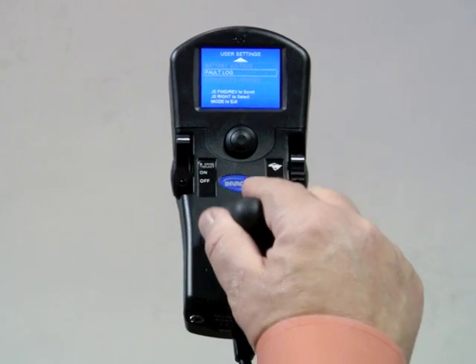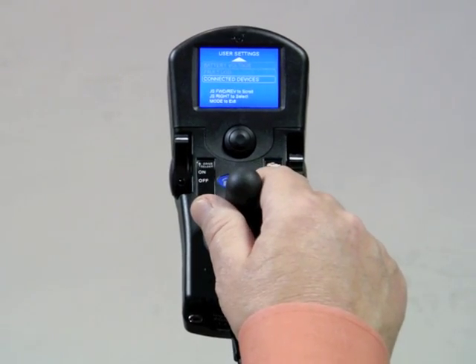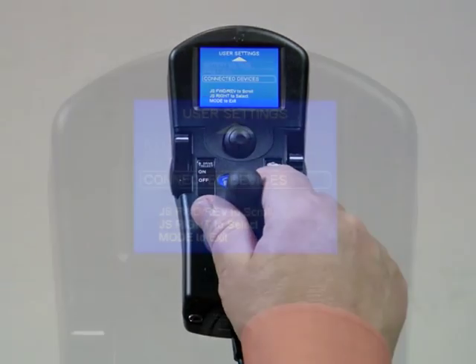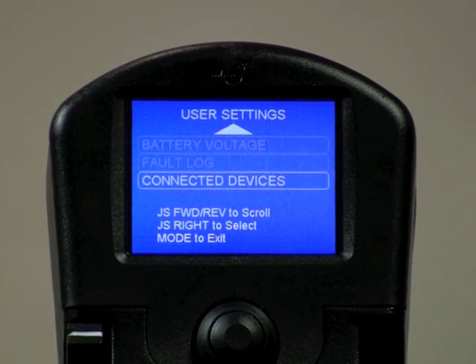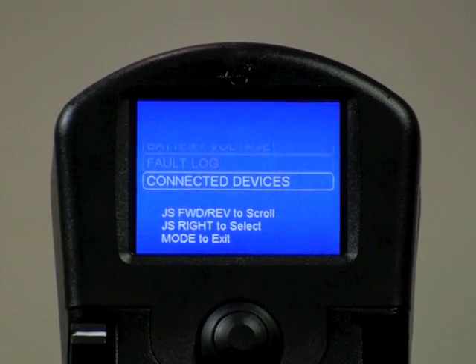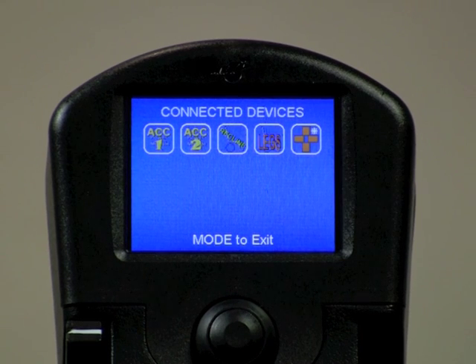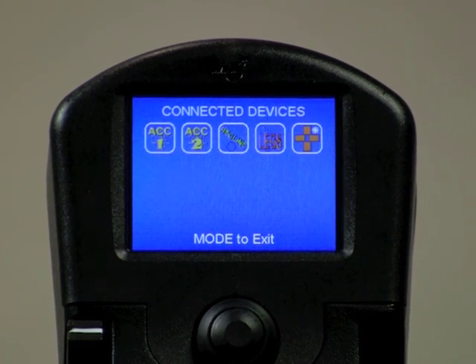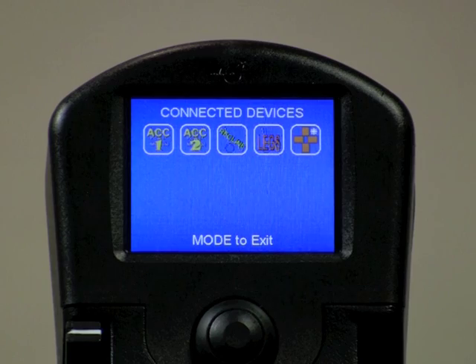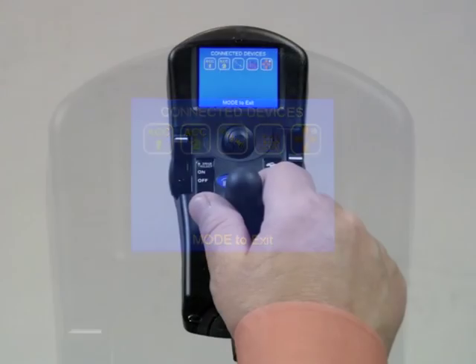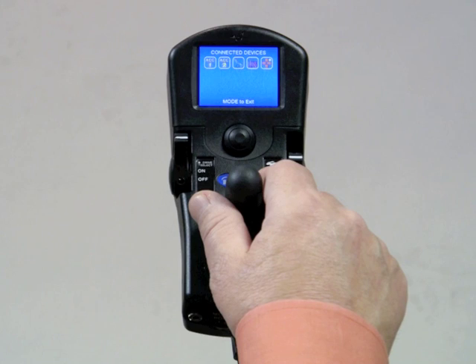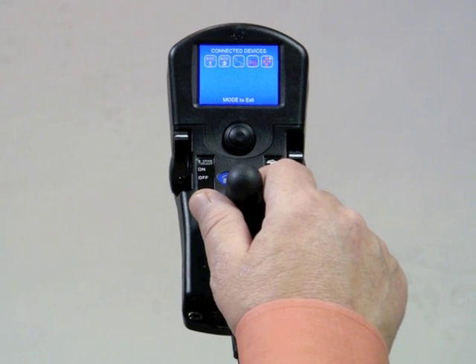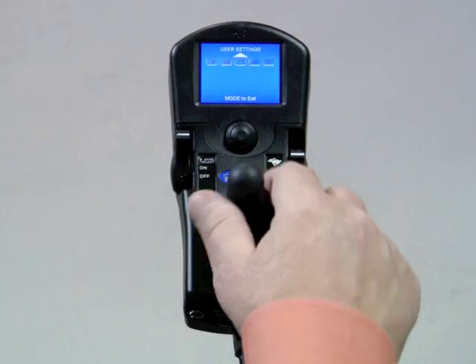A reverse driver command will highlight the last user screen option, connected devices. A right command will enter this field and a screen showing an icon for all of the devices plugged into the Mark 6 system will appear. A list matching each icon to its device can be found in both the owner's manual and the Mark 6 reference guide. Use the mode button to exit.